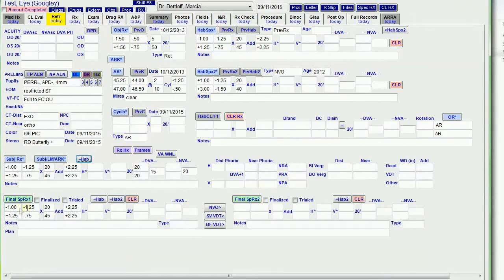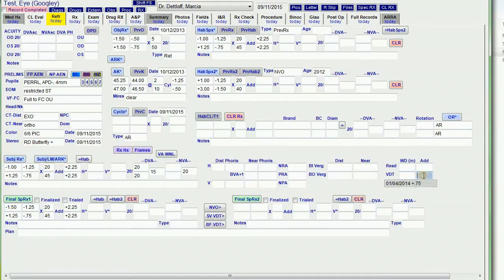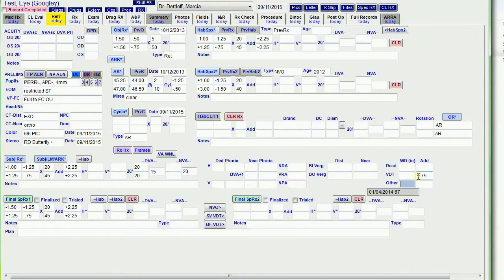But I can always modify these if I want to. So I'll make this a minus 150. Then I'm going to put over here a plus 75 for a special computer prescription.